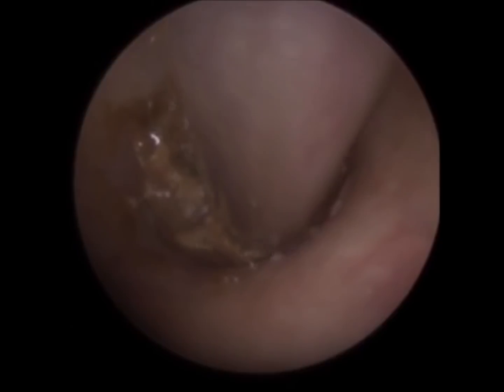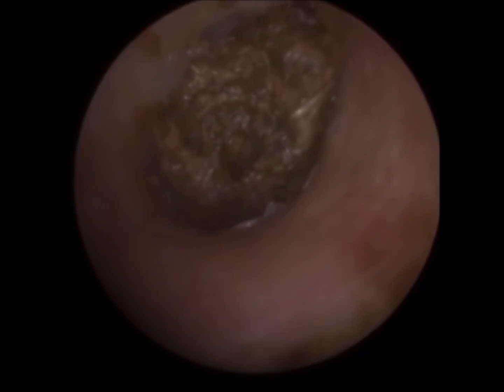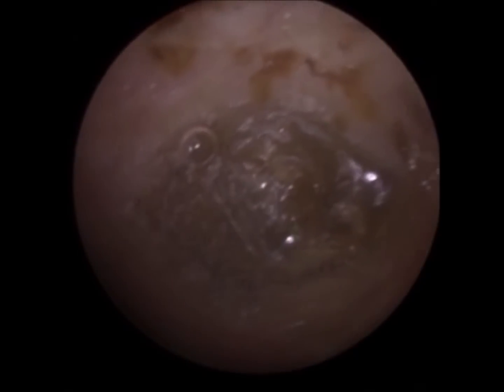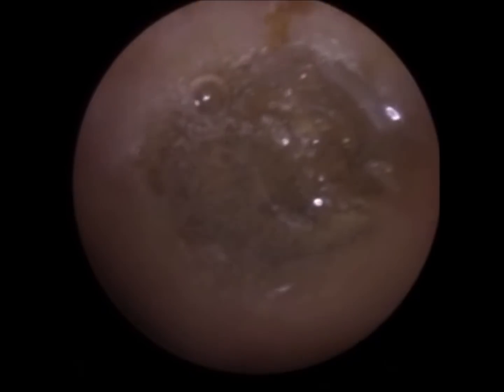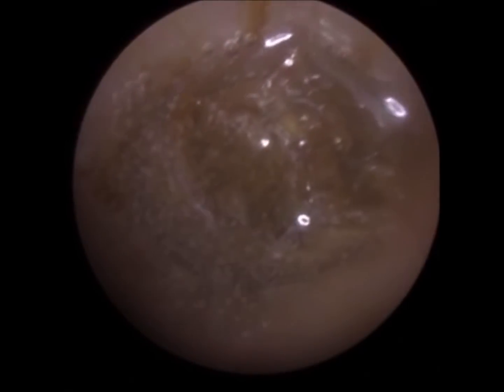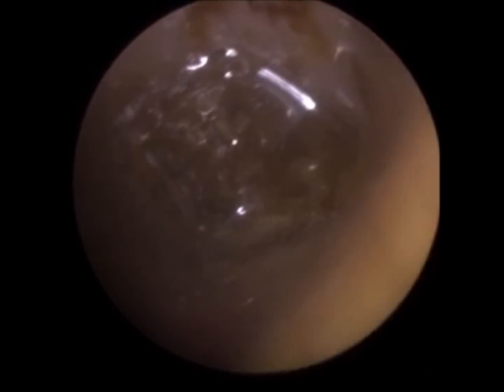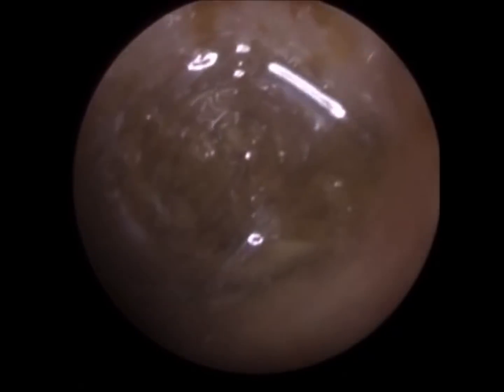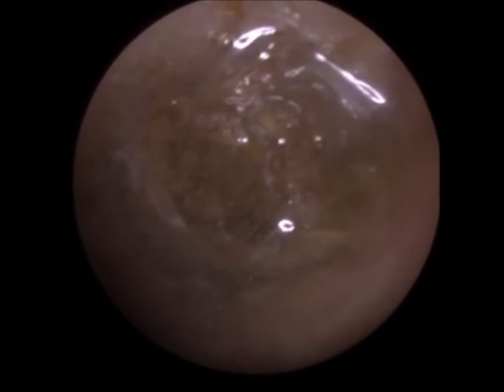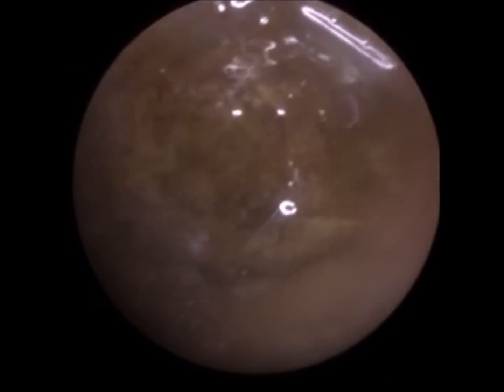And this wax is lodged in the isthmus. So the isthmus is beyond the second bend of the ear canal. It's where the ear canal narrows. And this is the bony part as well. So the bony part of the ear canal is very sensitive. The layer of skin that lines the bony part of the ear canal is 0.1 millimeters in thickness, whereas the skin that coats the cartilage portion of the ear canal, so the outer third, is a lot thicker, sometimes up to 5 to 10 times thicker. So we just have to be careful that we don't make contact with the bony part of the ear canal when we're doing procedures near the eardrum.